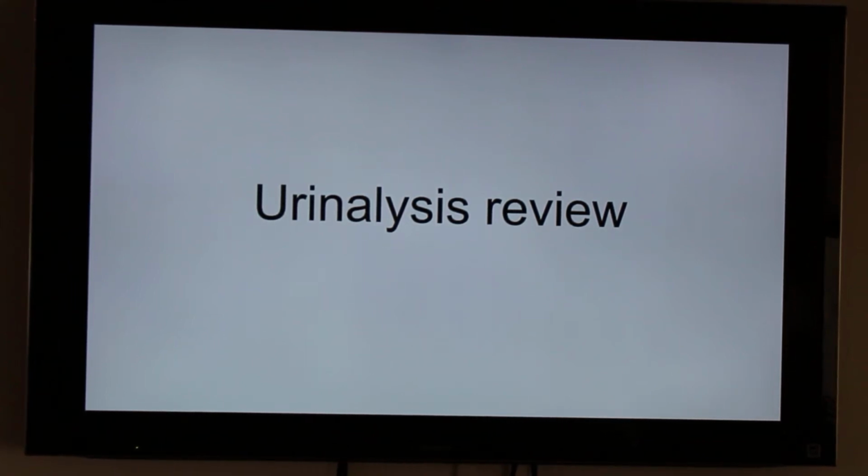Hey guys, just to follow up with what we've been looking at and reading this week, we're gonna talk about all the pictures that we have seen throughout the lecture. I really just want to make sure that you guys are comfortable with looking at sediments and what is in them. The first couple pictures we're going to look at come from the assignment, and then I've got a few extras after that.